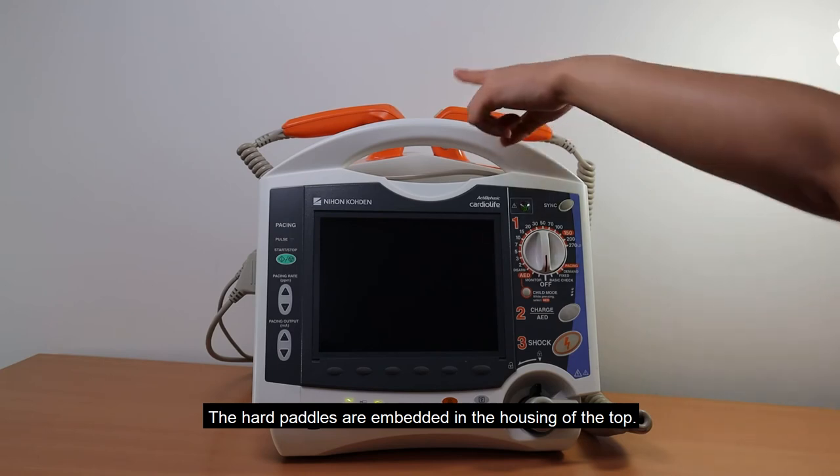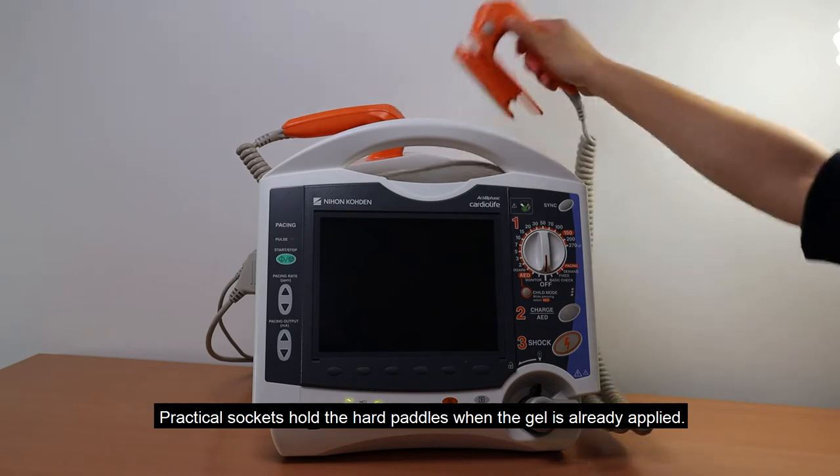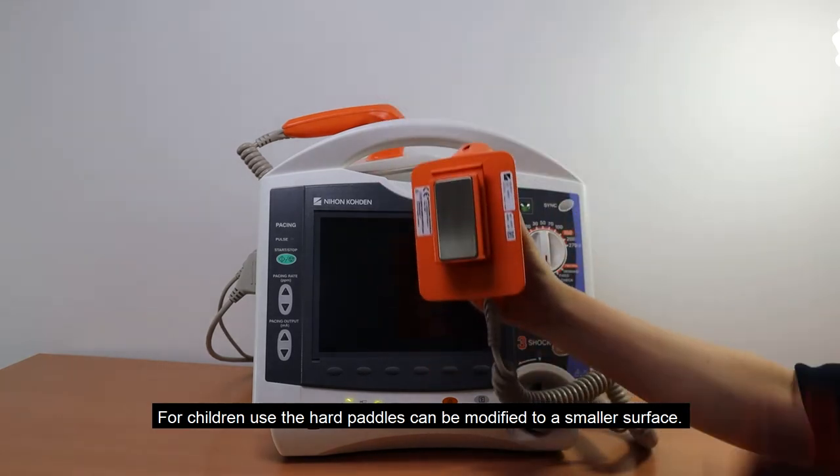The hard paddles are embedded in the housing of the top. Practical sockets hold the hard paddles when the gel is already applied. For children use, the hard paddles can be modified to a smaller surface.